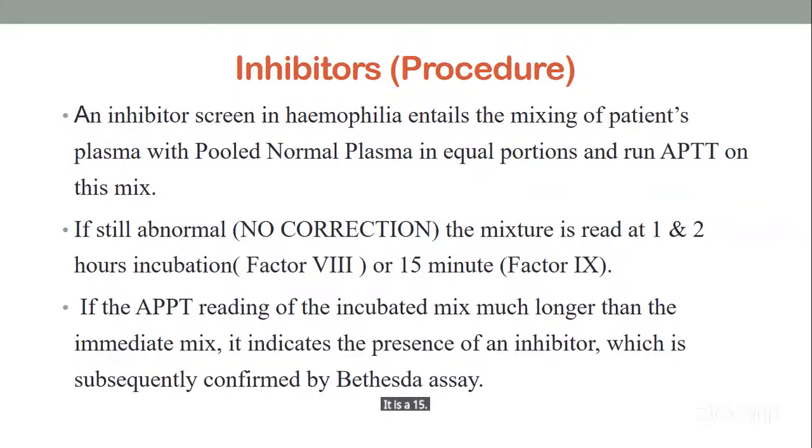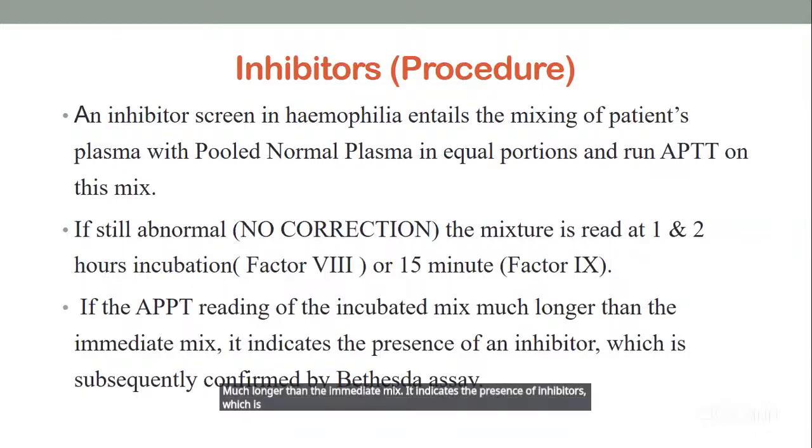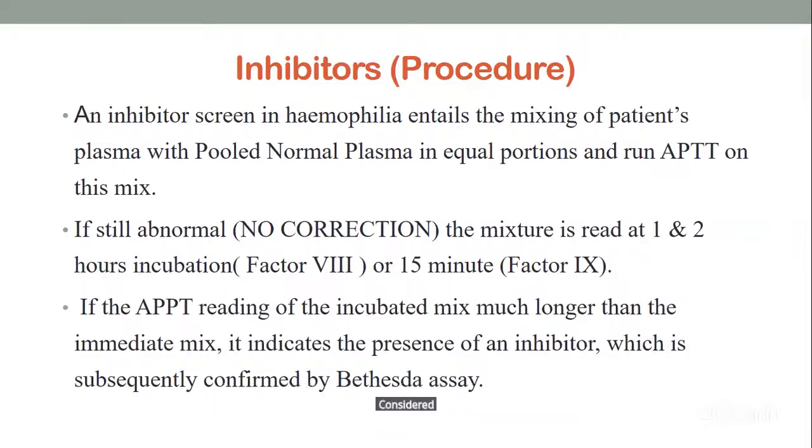If the APTT reading of the incubated mix is much longer than the immediate mix, it indicates the presence of inhibitors, which is subsequently confirmed by the Bethesda assay. Next slide.